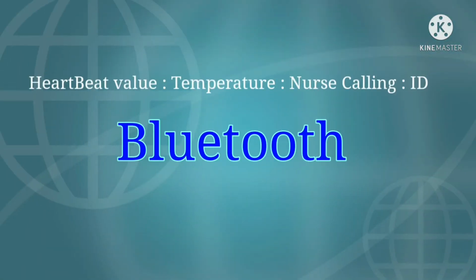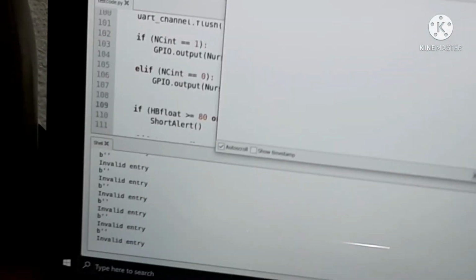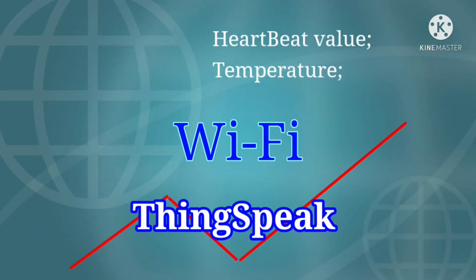Data for heartbeat, temperature, calling nurse and the patient's ID will be sent to Raspberry Pi through Bluetooth. This is how the data looks inside the Pi when there is no patient, and this is how it will turn to once patient ID is detected. The data is later sent to ThingSpeak through Wi-Fi.